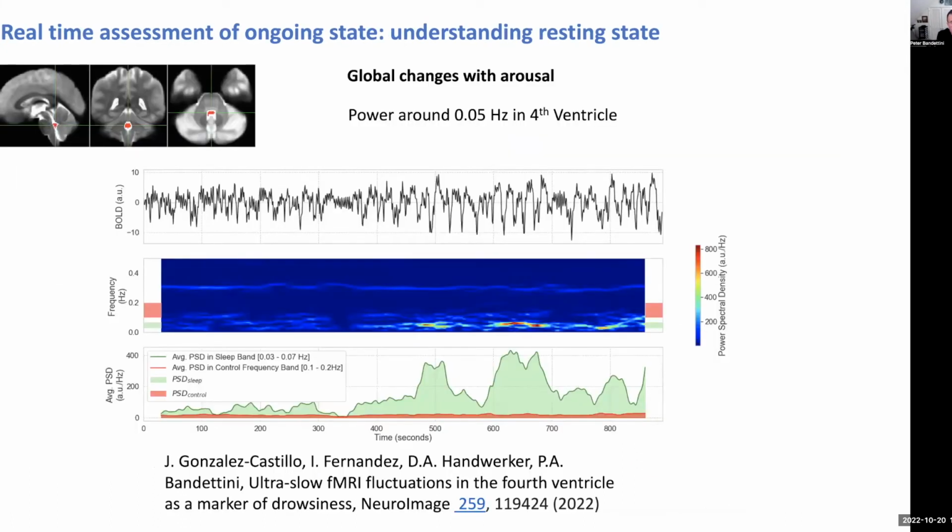Okay, so, ongoing along these lines, Laura Lewis, who is at MGH or associated with MGH, pioneered this to some degree, but we've reproduced her results. And we found that if you take a voxel and look at the fourth ventricle, which is interesting because it's not in gray matter, you find that the signal actually correlates with the whole cortex, and it looks something like the global BOLD signal, but it could also be the fourth ventricle.